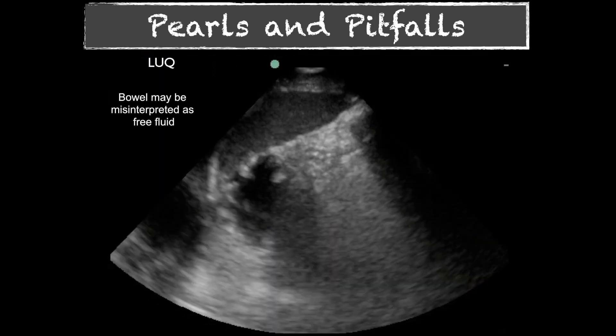In the left upper quadrant, bowel has also been mistaken for free fluid. A clue is that bowel looks fairly contained and you can see the hyperechoic inner bowel walls. Free fluid conforms to spaces and doesn't create its own shape — it would surround the spleen rather than forming a distinct rounded space. Newer users often mistake distended bowel for free fluid in the left upper quadrant, since the spleen is smaller and bowel is more commonly adjacent.